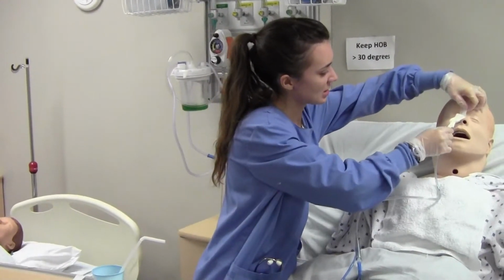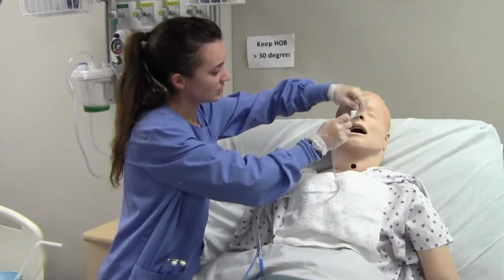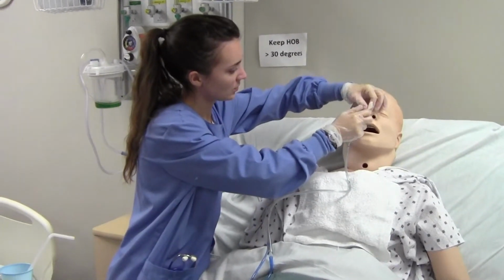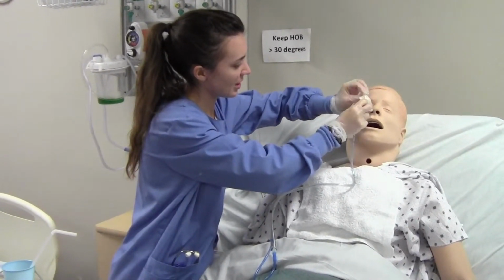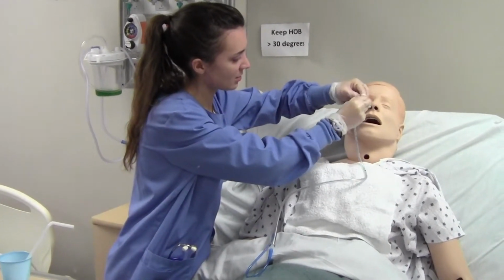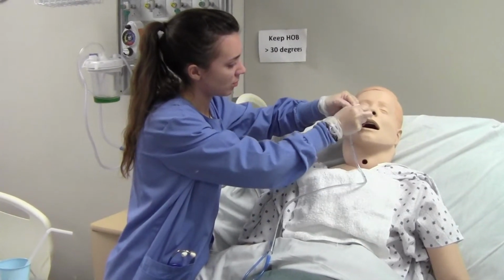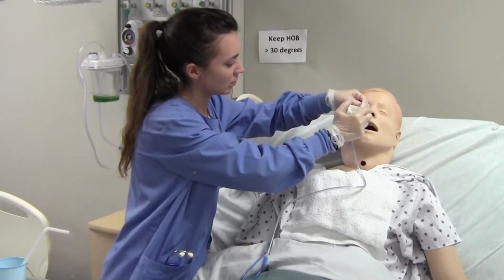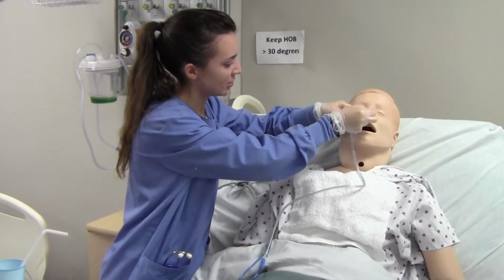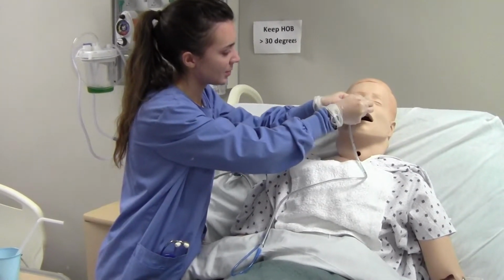So I'm going to take this initial tape off. I'm going to make sure to keep my hand securely on your tube though, so that making sure nothing's moving around. There's a lot of tape by your nose, don't worry. Be careful with that.